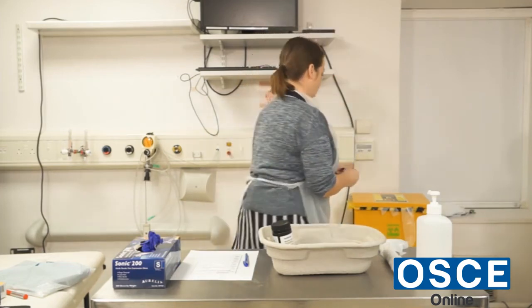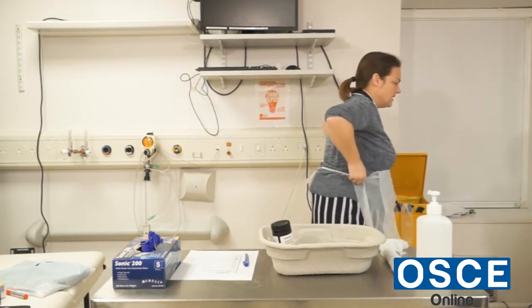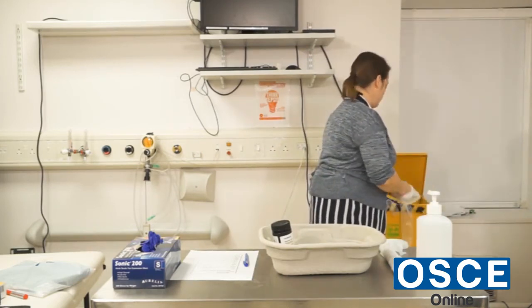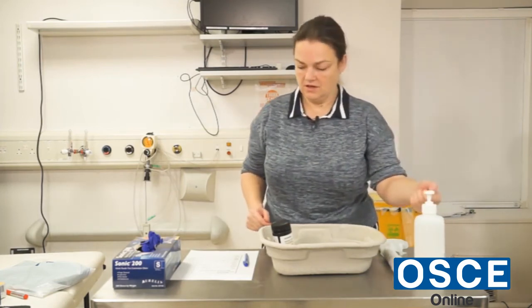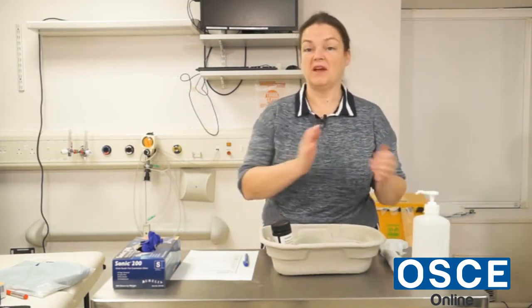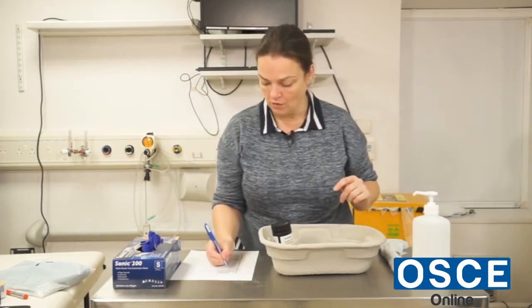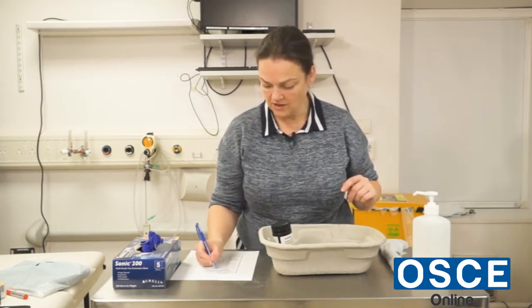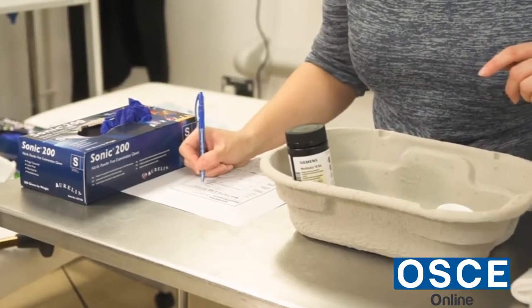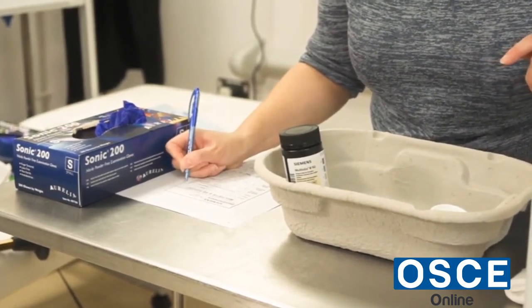Just going to put that into patient's household waste. Take off the apron and gel my hands. I would just go back and give the patient these results. Make sure that their name is on the form. So we've got Sarah Wilson, and the date today is the 1st of the 11th, 19.